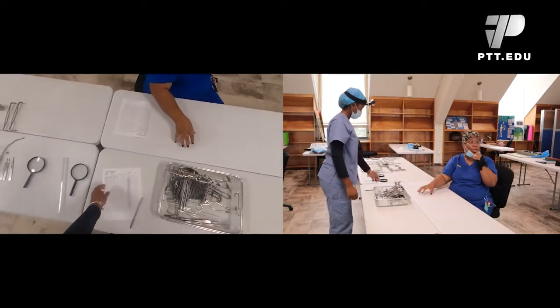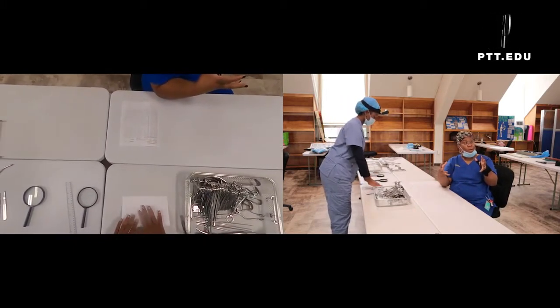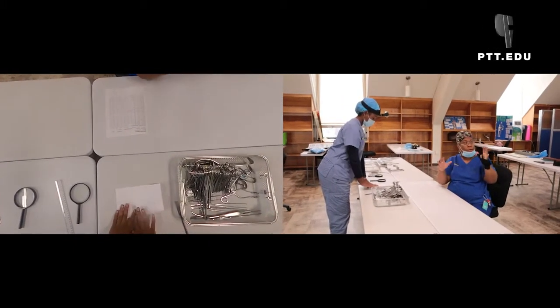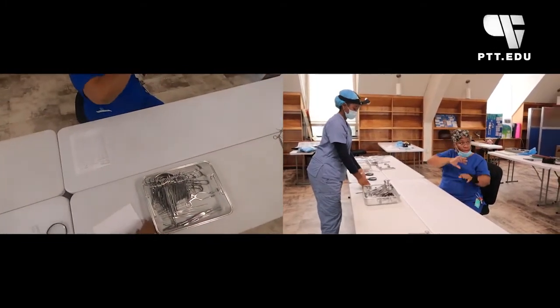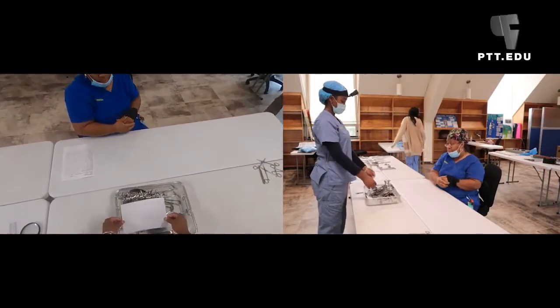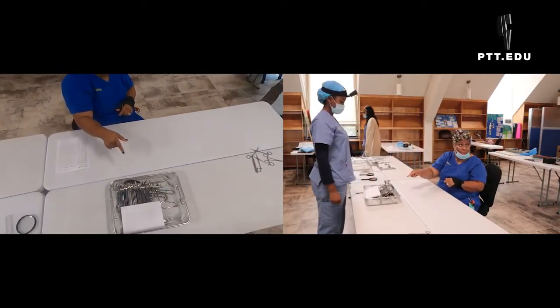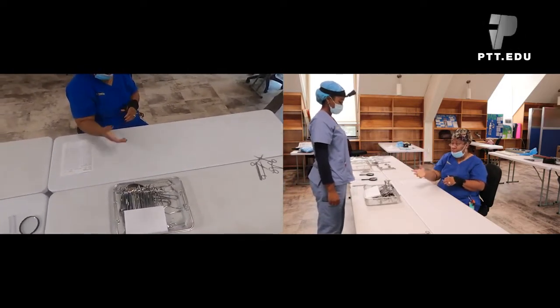So the sterilant that we use in high temperature sterilization is nothing but steam. Steam, like coming out of the shower, when the windows and the mirror are all foggy. You just have to wipe it down and you see yourself. So that's basically what this is. So as long as that indicator turns black on the inside, we're good to go. They're able to use it.